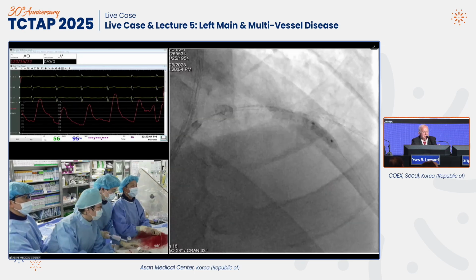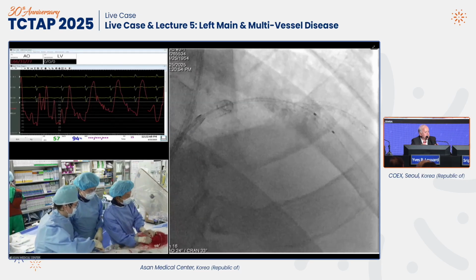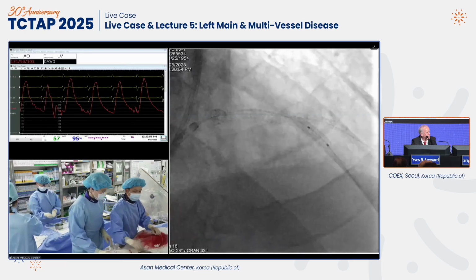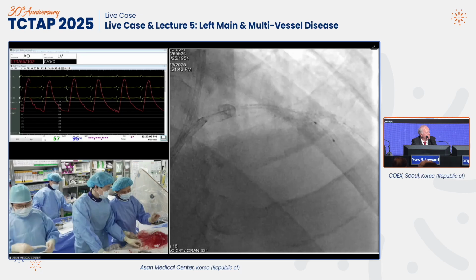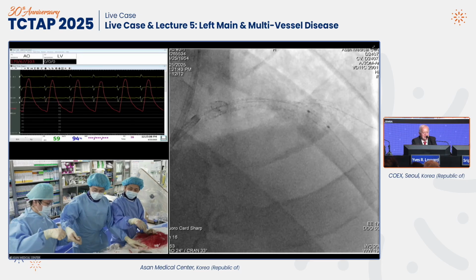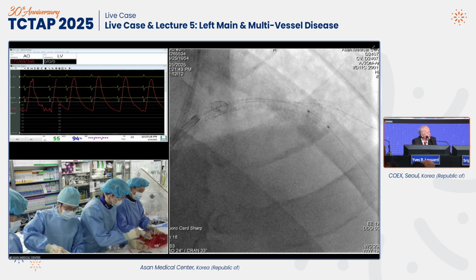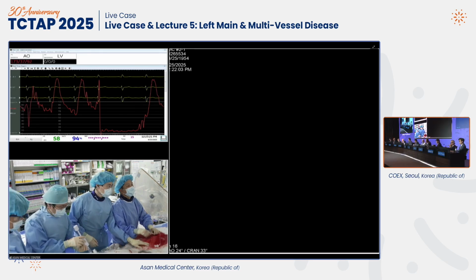We discussed this frequently with Youngkeun. I mean, the patients we are treating in Europe, especially in my country, and the patients who are treated in China are completely different. So you may justify probably in China to use this strategy as well, which was shown here. But regarding this lesion in particular, I would have done differently, so I cannot tell you if it will be better or not.